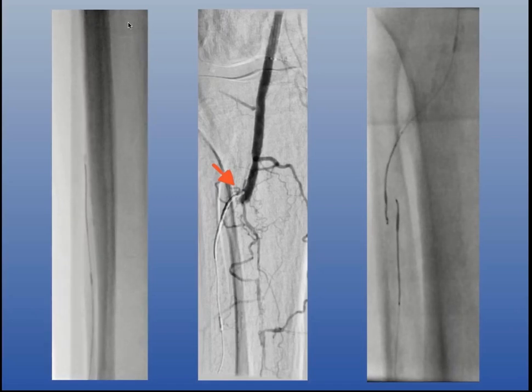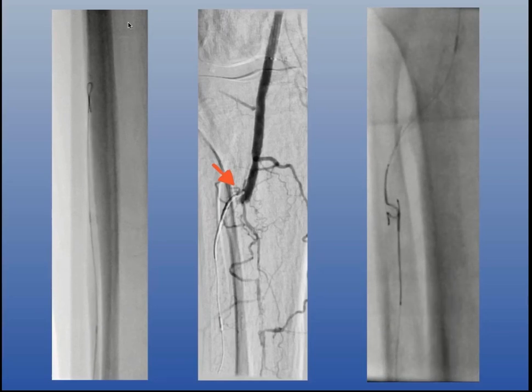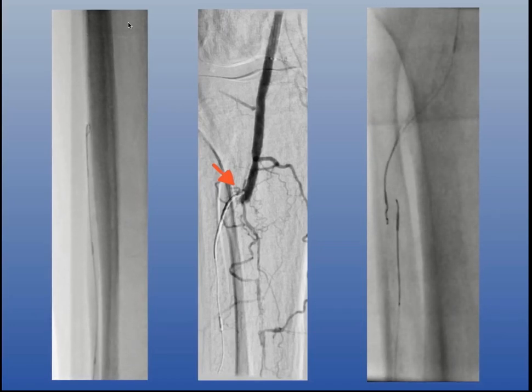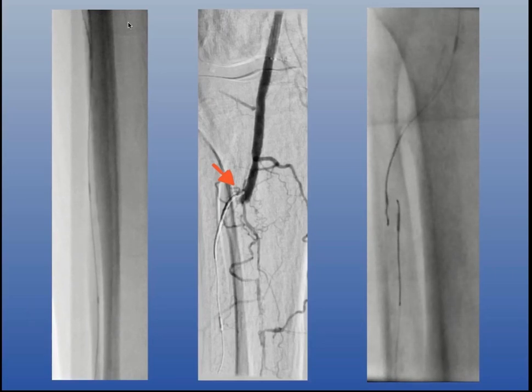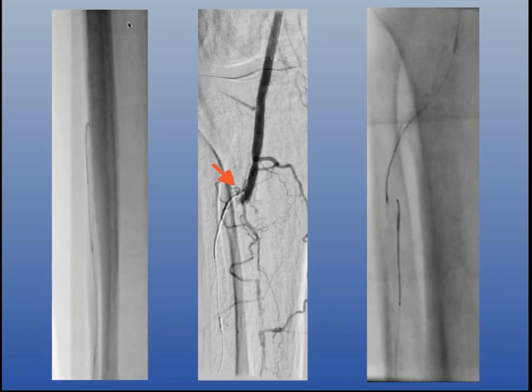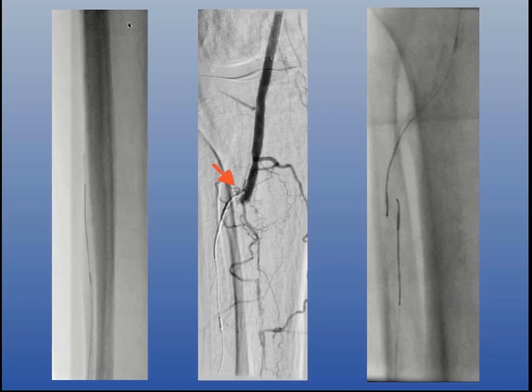And so at that point, what I did was I pulled the whole catheter and guide wire system from below down, and then I attempted the recanalization antegrade from above because I knew I could be intraluminal for that first few centimeters. And now I'm stuck in two different subintimal planes. So I think this is a good example of showing you what a lot of people talk about, right? I have a catheter and guide wire from above. I have a catheter and guide wire from below in that far right image. And I'm in two separate subintimal planes within the same anterior tibial artery.